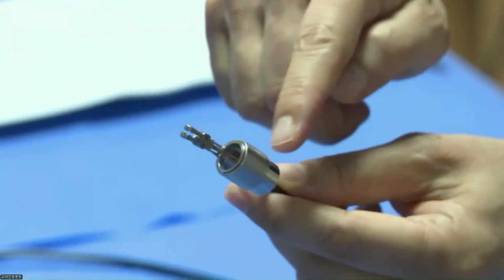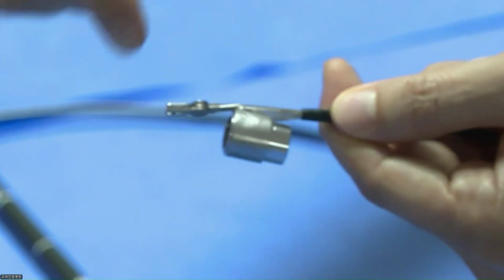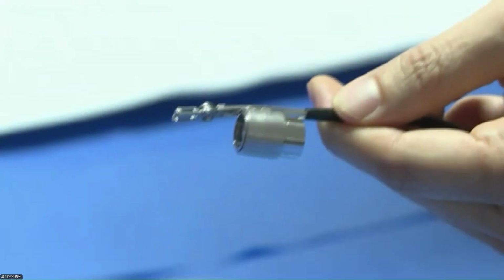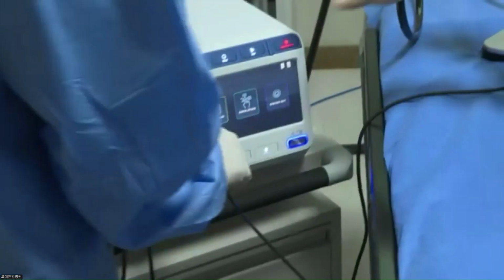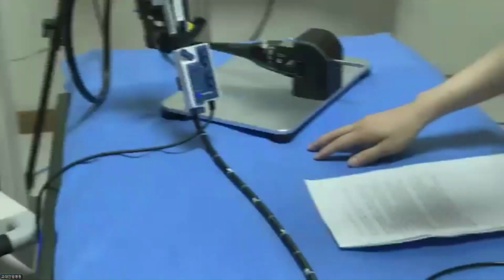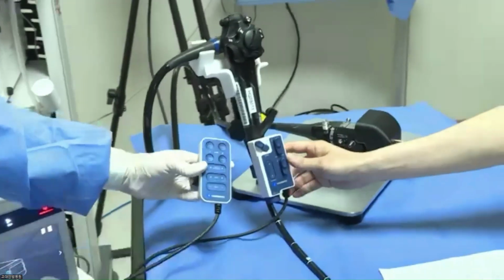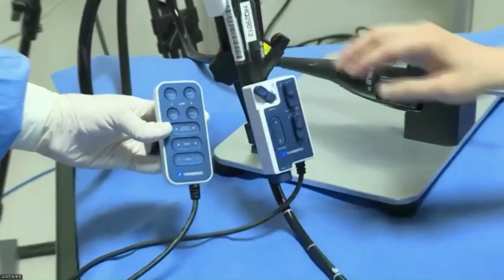Here is the head of the device, and then here is the arm, and then the wrist, and then the hand. And this is the cartridge to be inserted into the driving unit. You can see that this driving unit has two controllers, the button type and this lever type. But any type of controller can be used depending on the operator's preference.